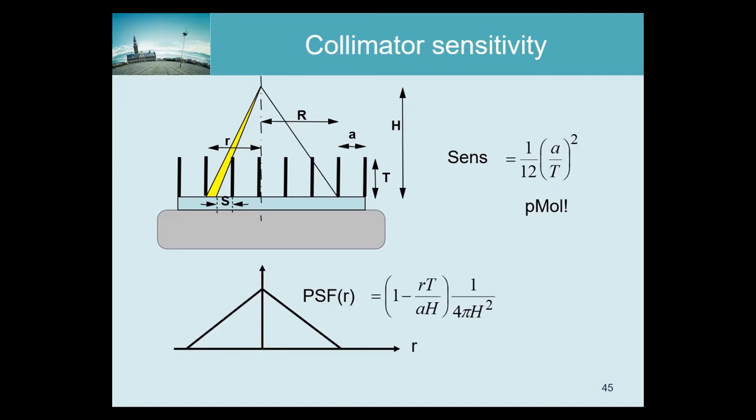If you put something in front of a gamma camera, then 1 in 5,000 or 1 in 7,000 of the photons emitted in any direction will be seen by the gamma camera. So 1 in 5,000 sounds like a small value, but of course this is about atom disintegration. So if 5,000 atoms decay, then one of them will be seen, which actually means that the gamma camera has a very spectacular sensitivity. And that allows it to see nanomole or even picomole concentrations, depending on the specific activity.